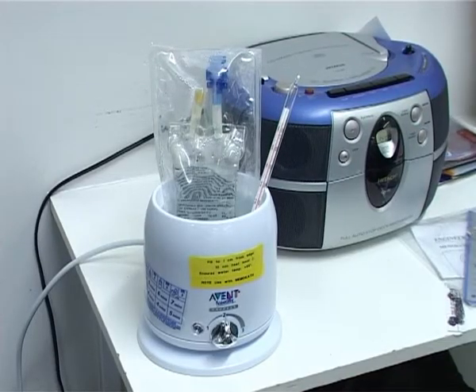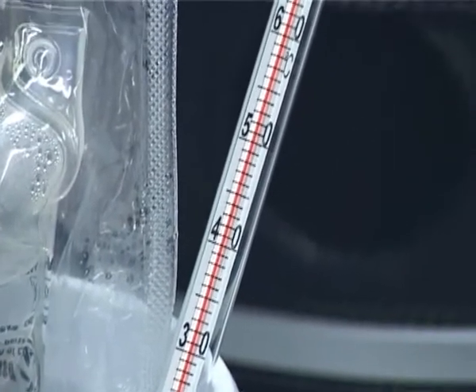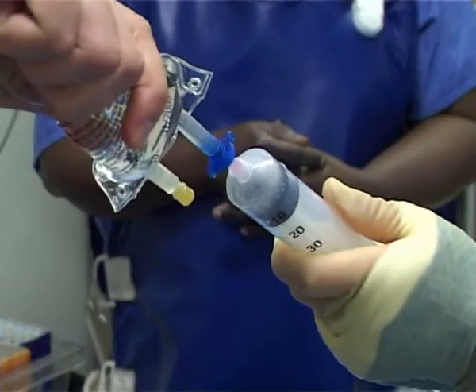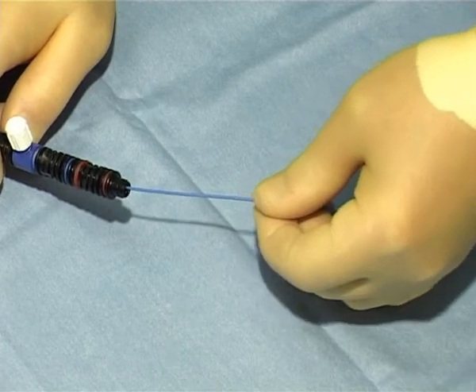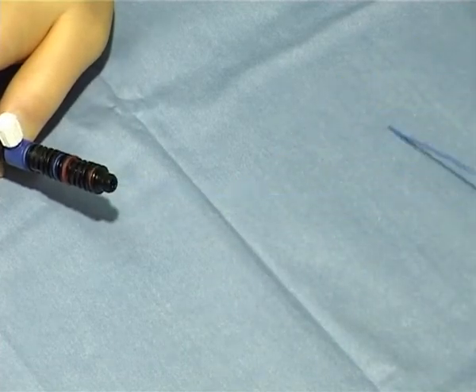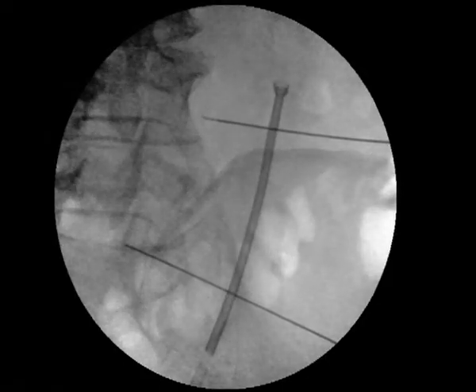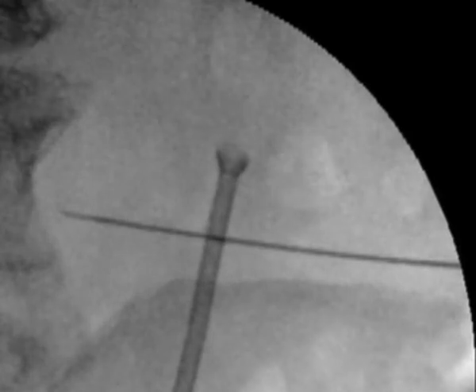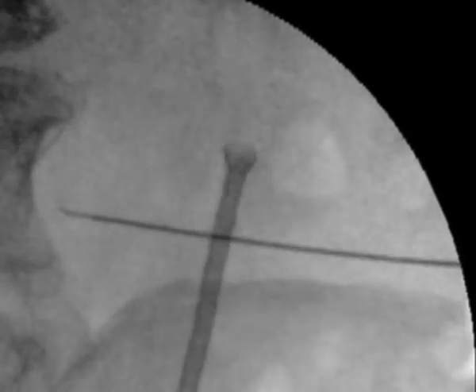20 ml of 60 degrees hot water is ready to be aspirated. After removal of the innermost blue mandrel of the insertion system, the water is flushed through the end port until thermoexpansion of the proximal stent tip above the stricture can be observed.